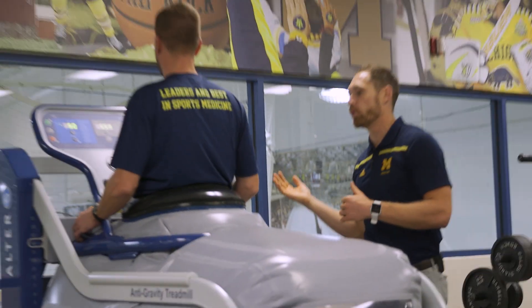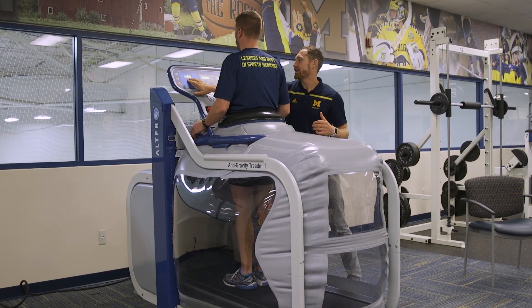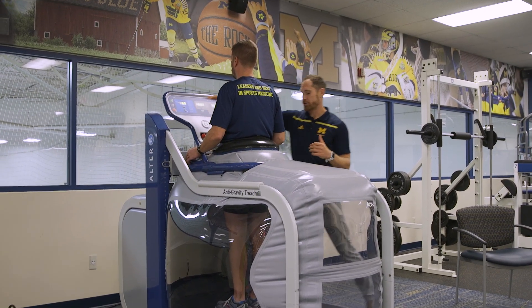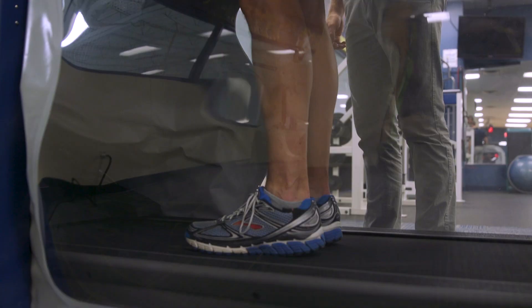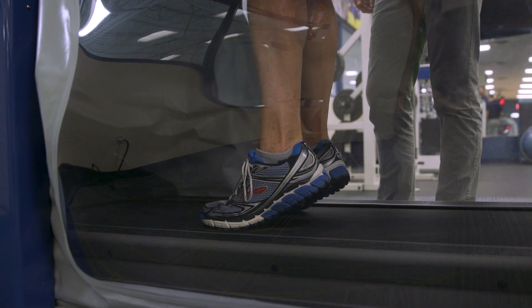Once you're done with your session, we recommend that you gradually bring them back up to full weight bearing. So if he's at 50%, I'd go up by 10 to 15% at a time, have them do another two to three or three to four heel raises, and then go all the way to 100%.